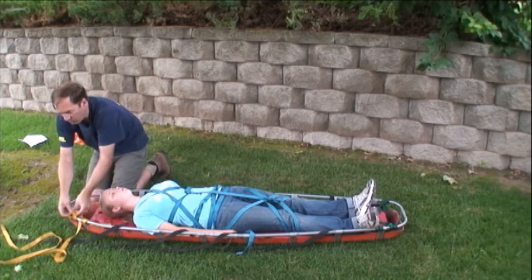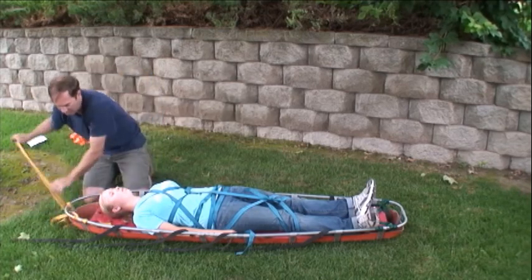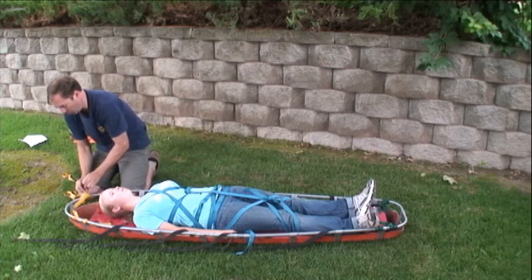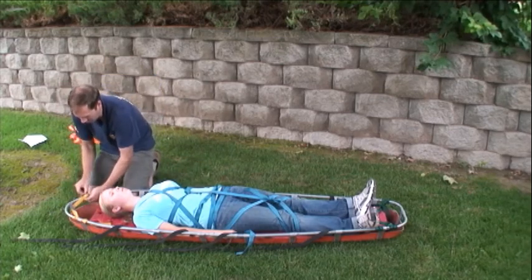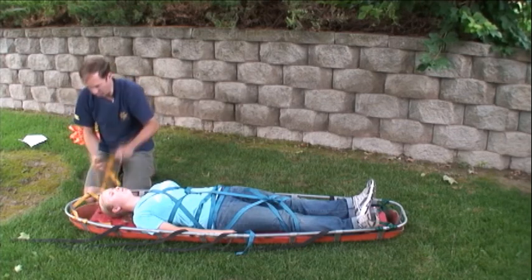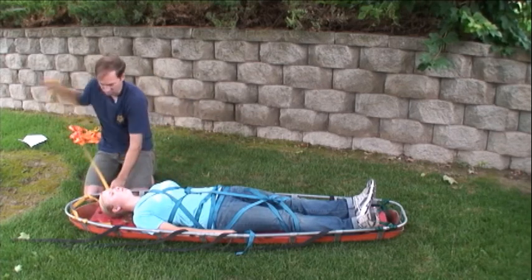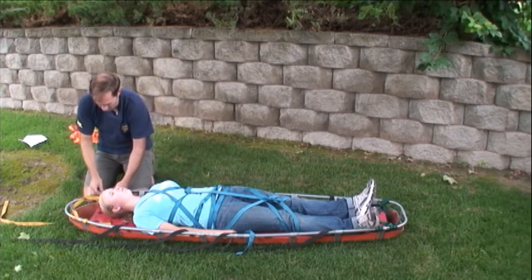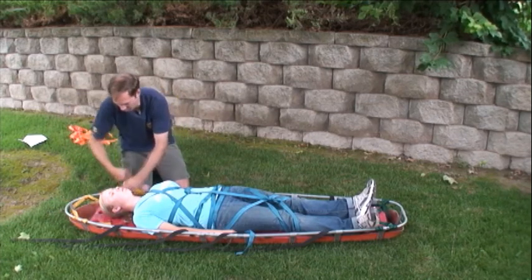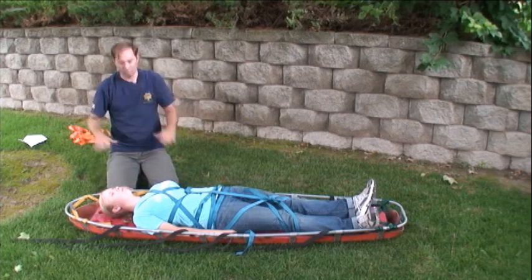Then add a few more clove hitches. What is particularly helpful is going over that bar to keep the webbing away from the patient's head. Notice the clove hitch is on the bar — you might think it could slide loose, but after attaching it to the backboard it really doesn't slide either way. Finish with the round turn and overhand, then tie off any excess webbing to get it out of the way.